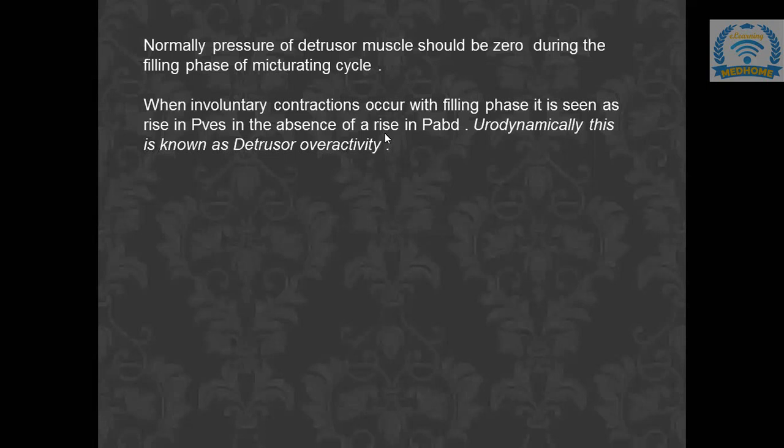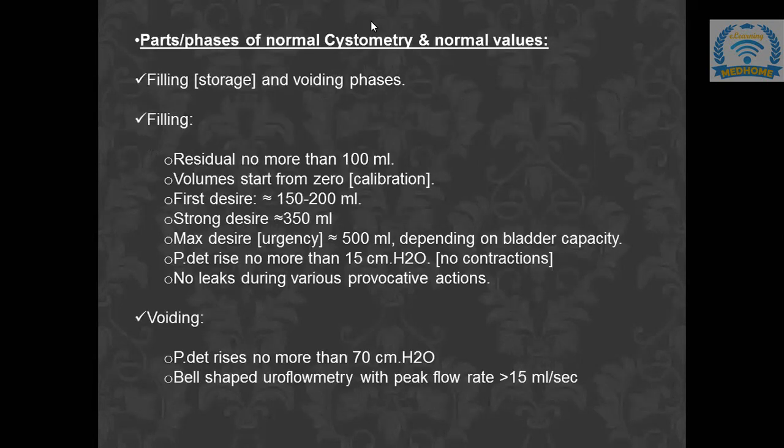Vesical pressure and also the detrusor pressure. Sorry, I didn't get your question. Can you please repeat it? Okay. Ma'am, I understand that in overactive bladder, both vesical and detrusor pressure rise during filling time. Yes, you're right. Both pressures rise, but the abdominal pressure will not rise. Okay, yes. Thank you, I got it.